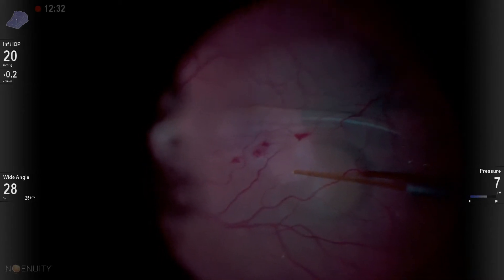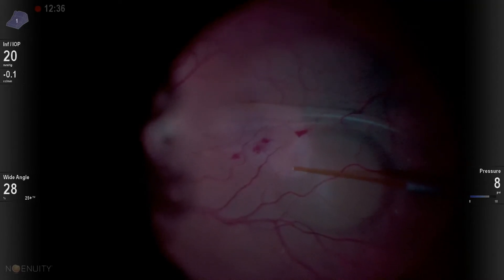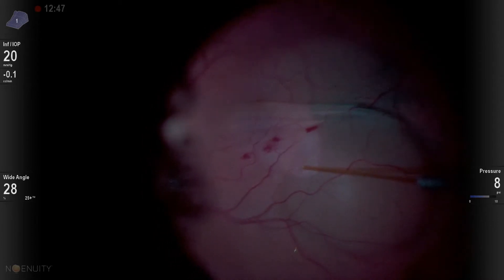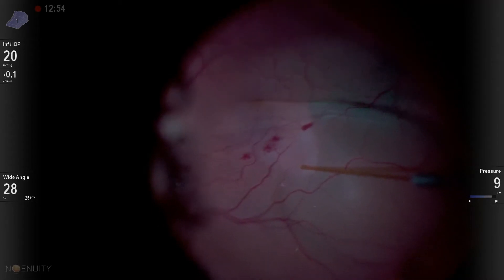So I'm using a 39-gauge cannula, and I'm injecting BSS underneath the retina here, and the first problem is that the BSS doesn't dissect under the macula. It actually dissects out towards the periphery. And so I'm thinking to myself as I inject this, how in the world can I get this BSS to go the direction that I want?